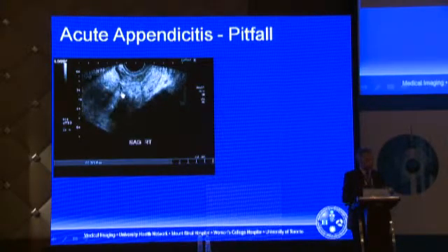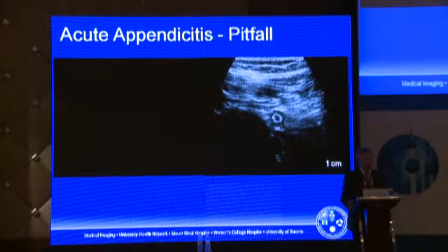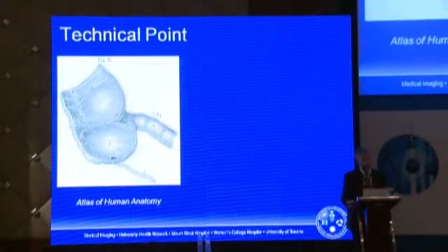The patient had a very good history for an acute appendicitis, and sometimes I think I press a little harder maybe than the technologist, so just scanning suprapubically or transabdominally, I was able to identify this acute appendicitis that was much higher up. And I honestly don't know what that structure in the pelvis is. I don't know if it's part of a normal fallopian tube, but if you're going to call an appendix normal, it's nice to see it coming off the cecum and following it all the way to the tip. So there are pitfalls in just relying solely on ultrasound.